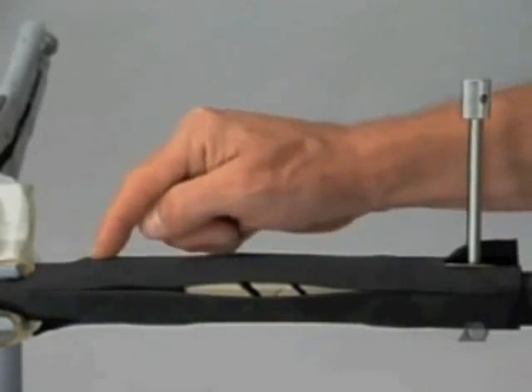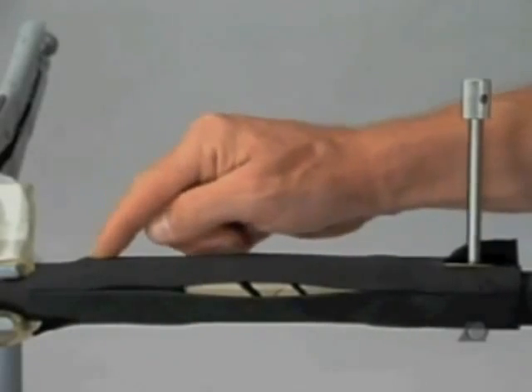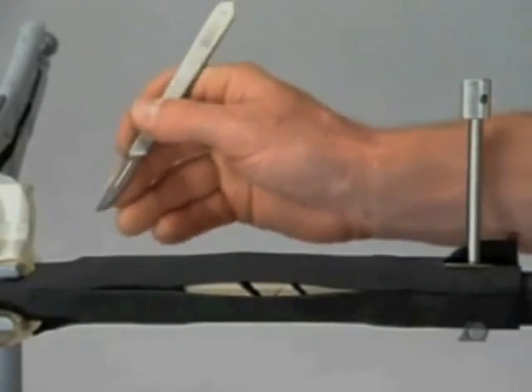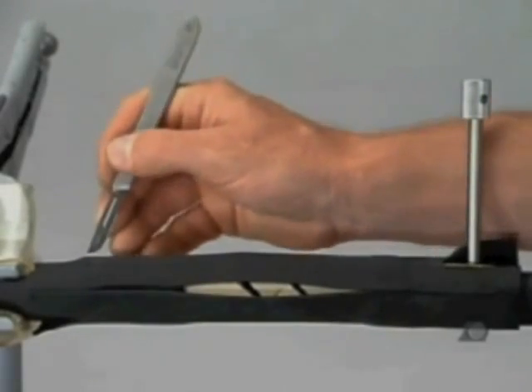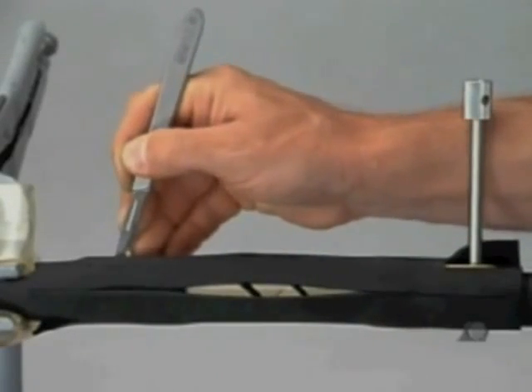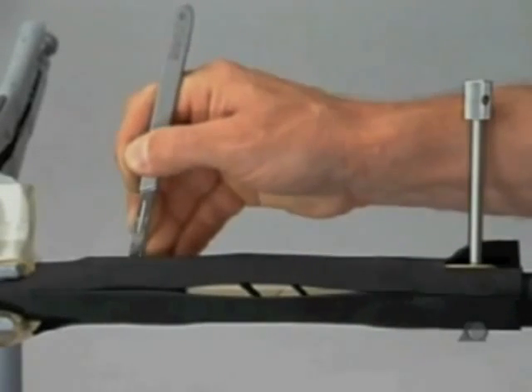After palpation of the plate, a second short incision is made to allow the second drill sleeve to be firmly screwed into the end hole of the plate.